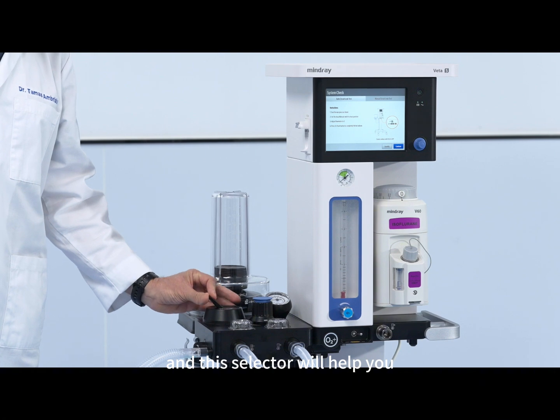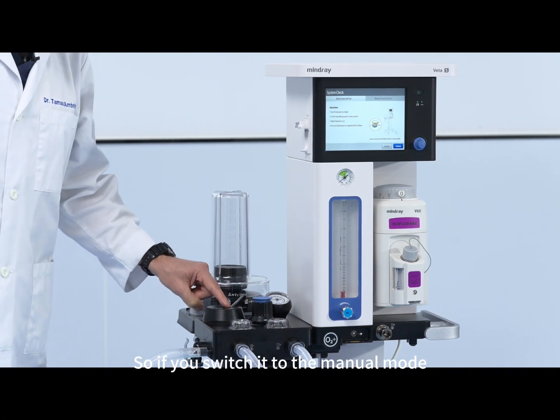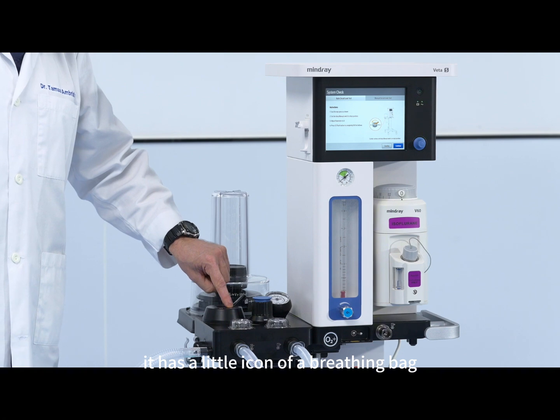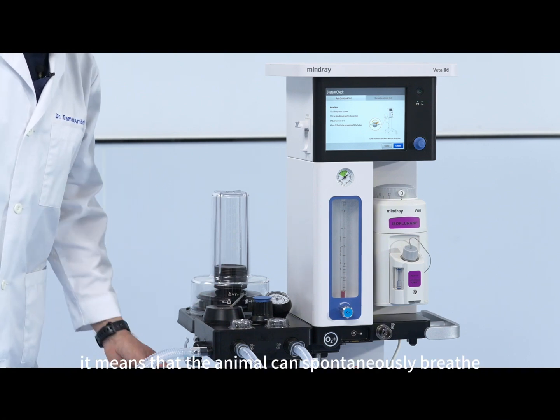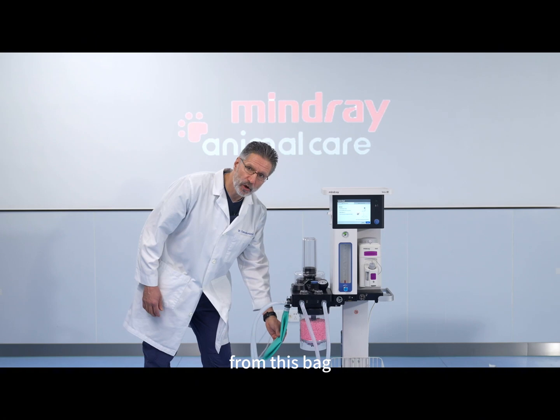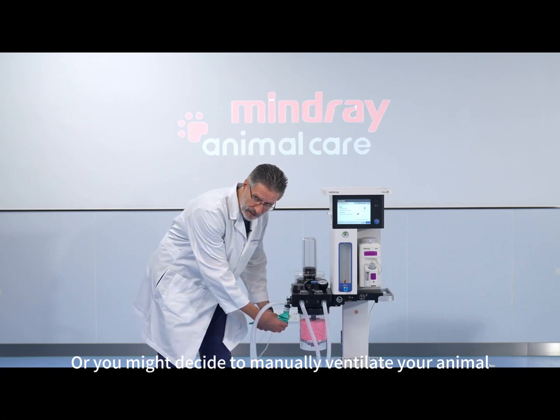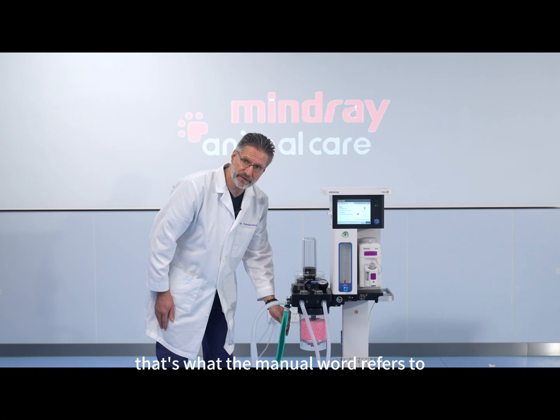This selector will help you switch into the appropriate mode. If you switch it to the manual mode, it has a little icon of a breathing bag, meaning that the animal can spontaneously breathe from this bag, or you might decide to manually ventilate your animal. That's what the manual mode refers to.